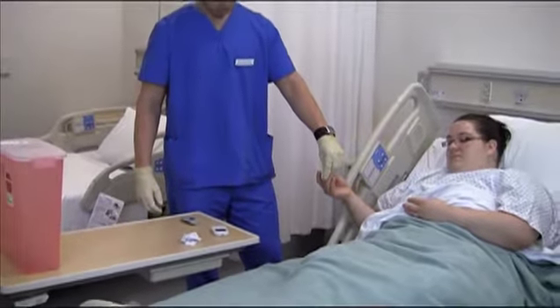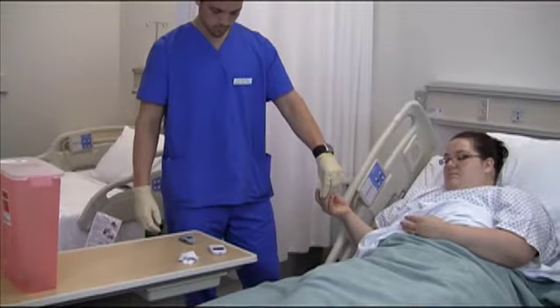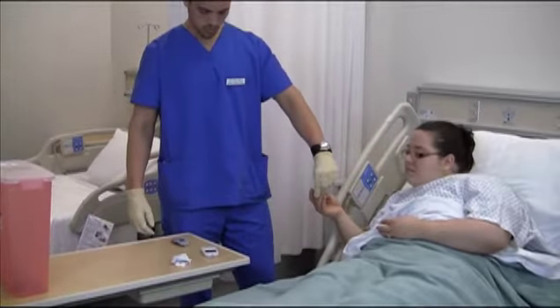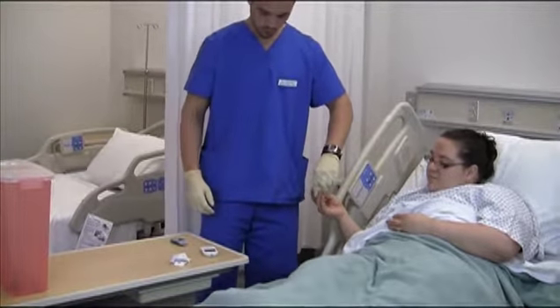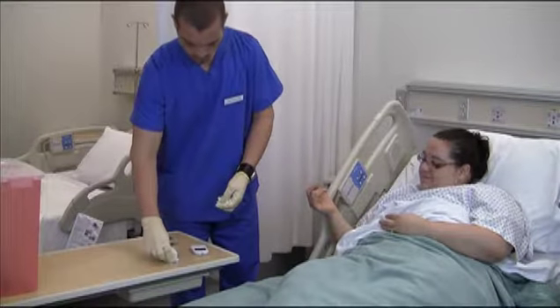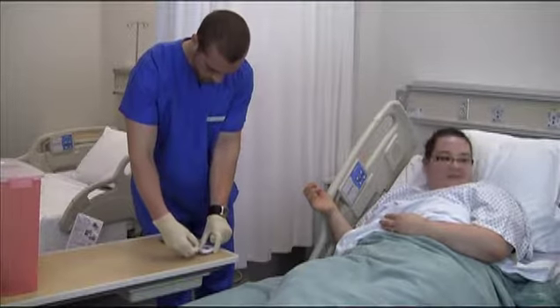Time the procedure accurately, if necessary. Read the results at the correct time.